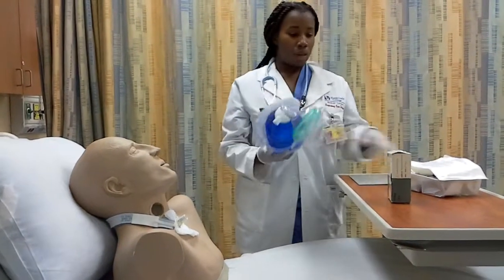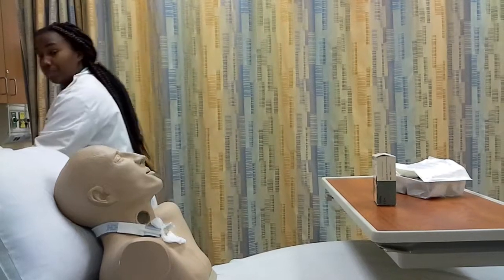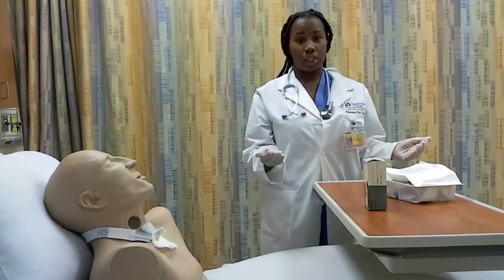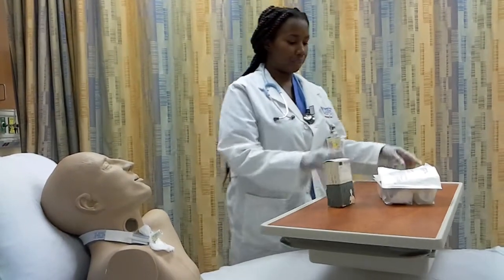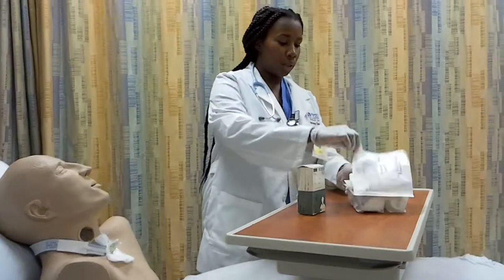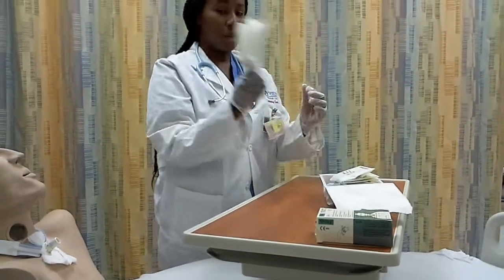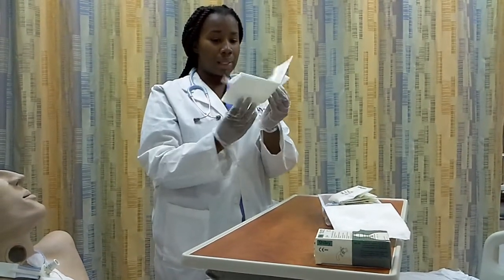So I've done that, so now I'm going to put this out of the way. That way I can create my sterile field, so I can make sure I'm doing a sterile procedure while I'm doing trach care. So I'm opening the box. And this is the padding. The padding, the side that I touch, I'm going to place that side down.